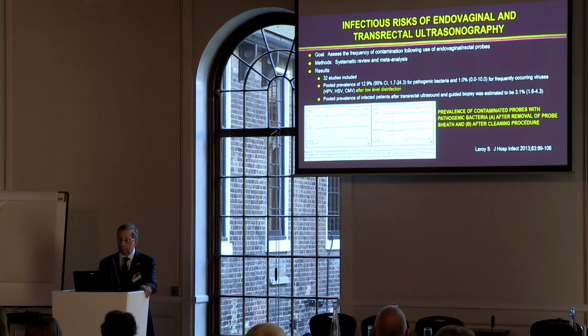Again, infectious risks of endovaginal and transrectal ultrasonography. Again, assess the frequency of contamination following use of these devices. This was a systematic review and meta-analysis that Dr. Leroy presented in the Journal of Hospital Infection several years ago. It looked at 32 studies. The pooled prevalence was about 13% for pathogenic bacteria and 1% for frequently occurring viruses after low-level disinfection.